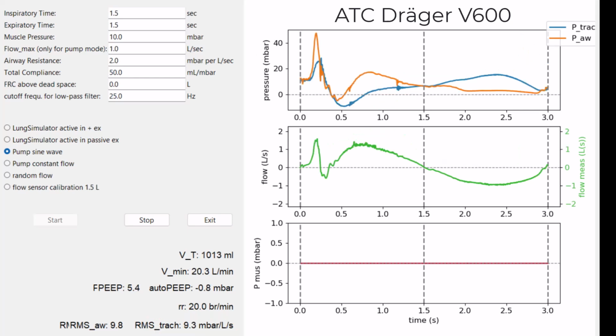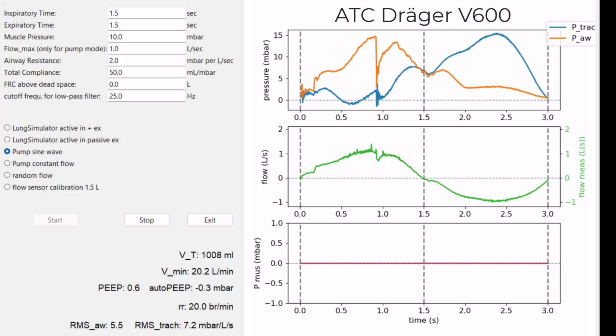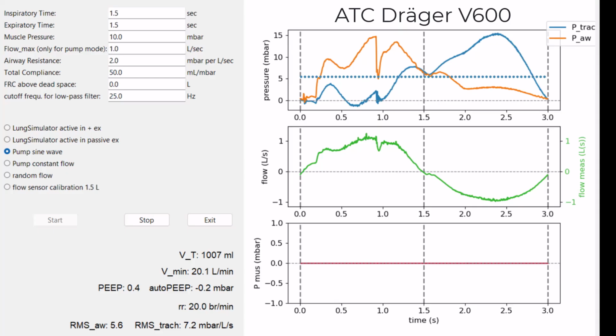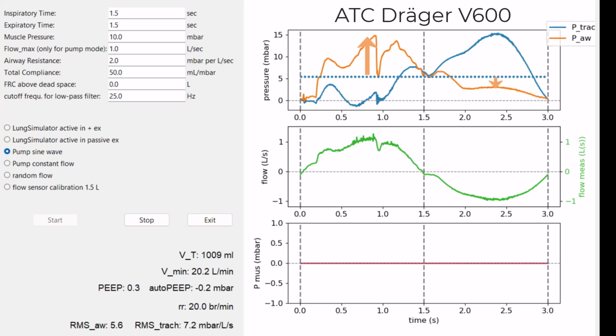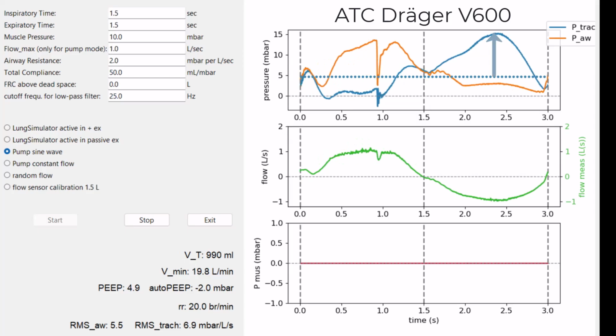What we are now doing is we are connecting our lung simulator to our Dräger V600 ventilator in ATC mode. PEEP is 5. And as you will notice, the ventilator needs a few seconds to adjust its control parameters. So the tracheal pressure is supposed to be on this blue dotted line. So it should be constant. It is not. Airway pressure increases in inspiration and the ventilator tries to decrease it, but it can't decrease it below 0. And so we see that the tracheal pressure increases also in expiration.